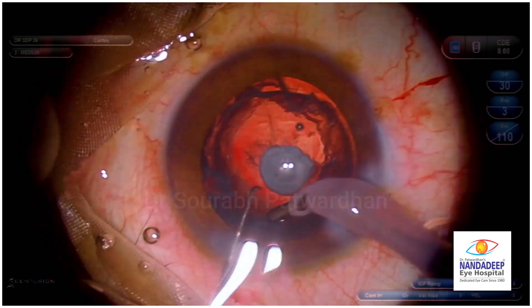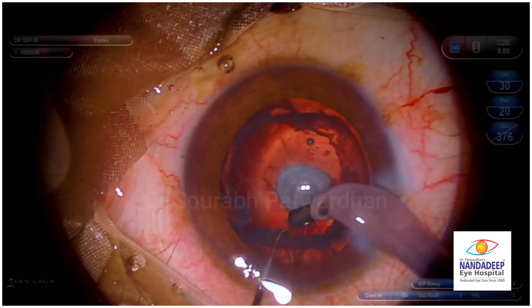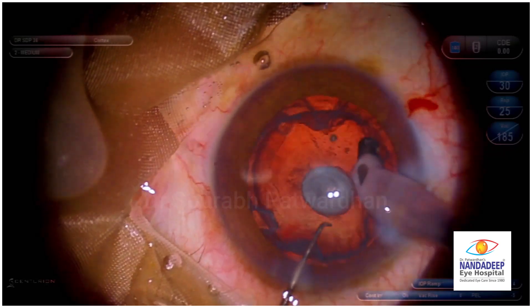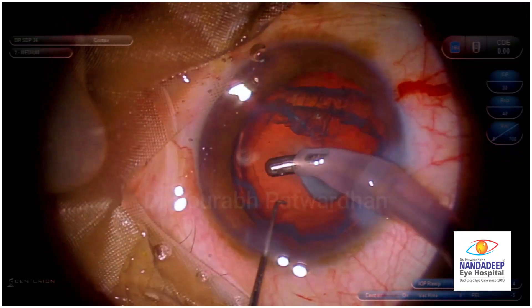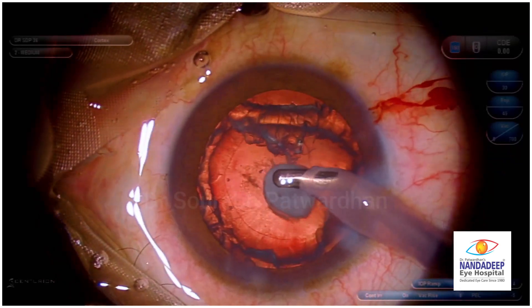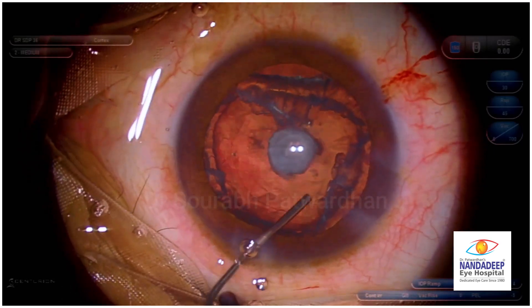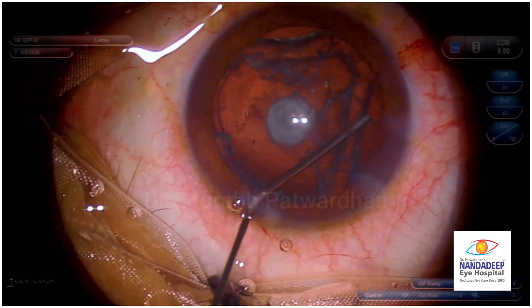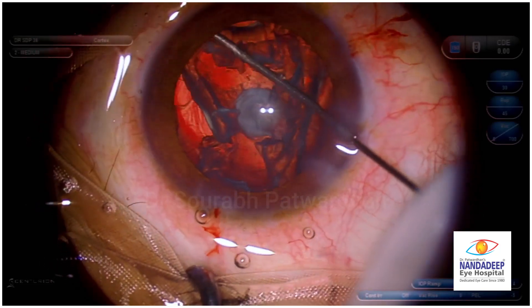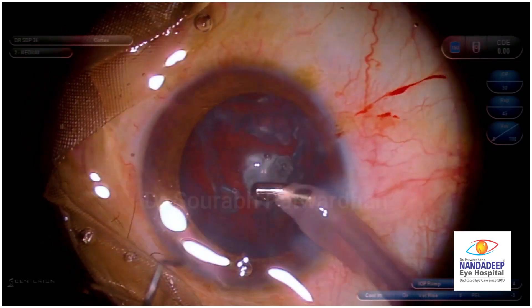Even for IA I am going to use 30 mmHg pressure. I am used to the coaxial IA — it also maintains the anterior chamber better, so I am sticking to that at this point. Bimanual is better in these cases for the sub-incisional cortex. What I am doing here is trying to pull the cortex from the periphery so that it dislodges the epinucleus as well. There is always a difficulty in removing this epinucleus, so viscodissection helps in these cases. I am using 1% hyaluronate, going just as we do hydrodissection, but instead of BSS I am using the hyaluronate to dissect out this epinucleus.